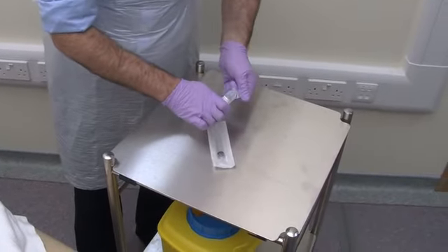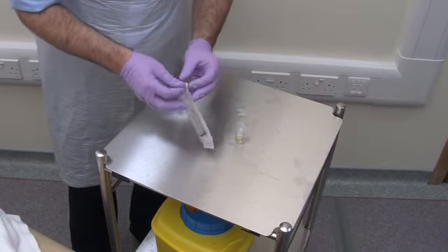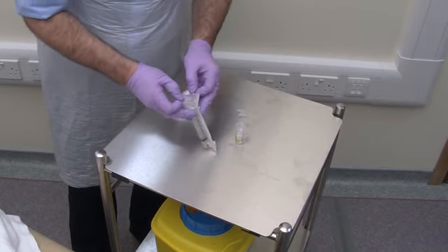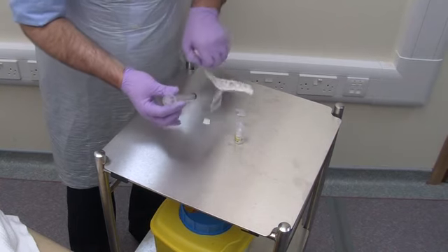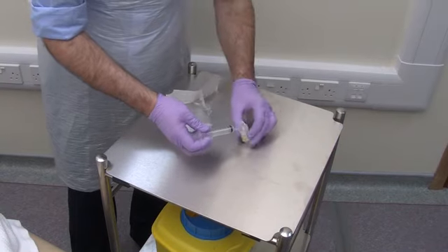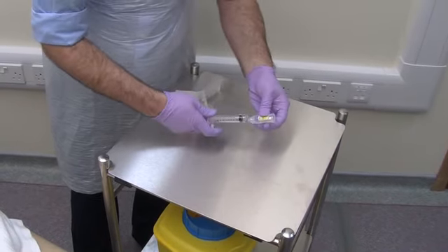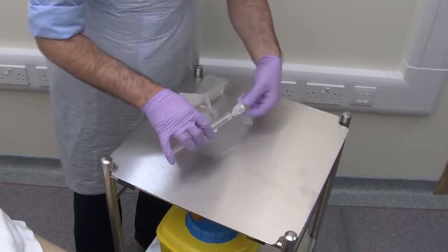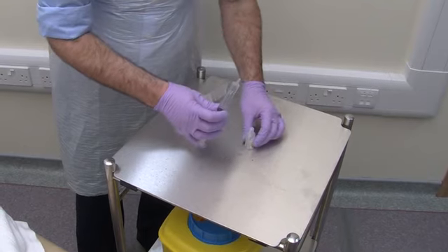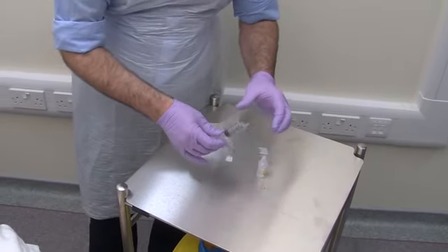The cannula should then be flushed with 2 ml of 0.9% saline. Open a new syringe and draw up the saline solution. Remove any air bubbles from the syringe.